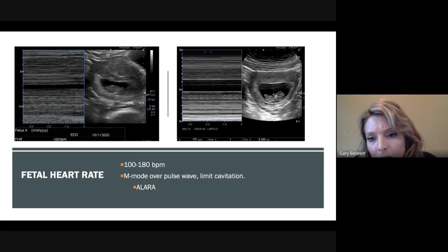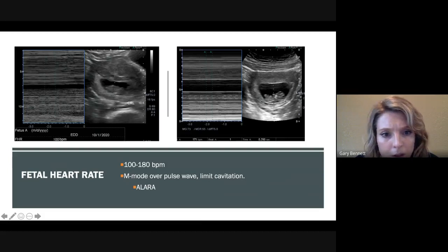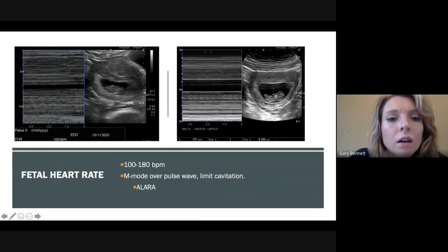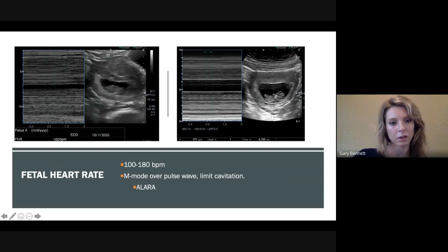Nothing super exciting in these ones. These are vessels down here behind baby. Hard to say really what this little hypoechoic line is there. Probably just another vessel. Ooh, here we go. Right here on the left one, that looks like a little bit of a subchorionic hemorrhage right there. Not super concerned. Looks like it's already clotting. Probably going to be just fine, but just so that your eyes see that.